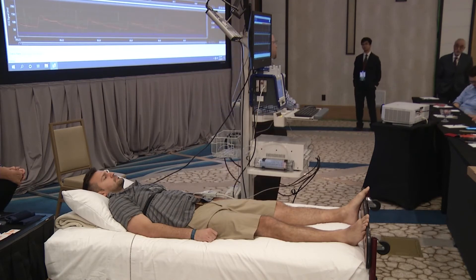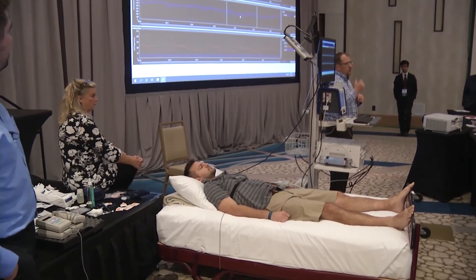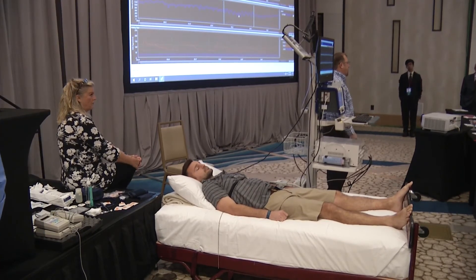Some of the other things that are really important: making sure you have the right cuff size. If you're using the wrong size cuff, it can either over-read or under-read the blood pressure, just like a normal manual blood pressure cuff would do the same thing.